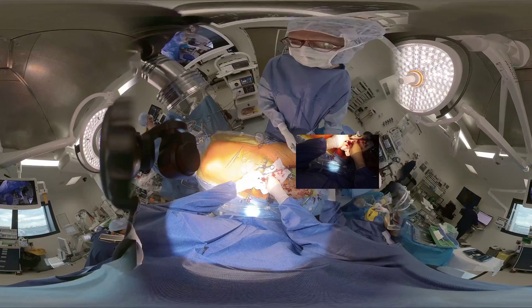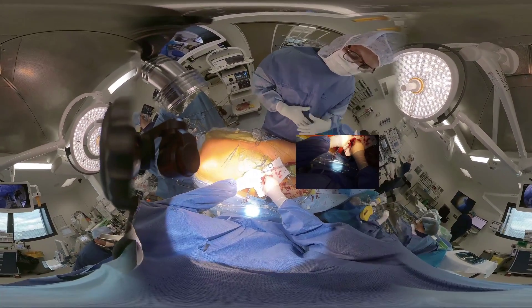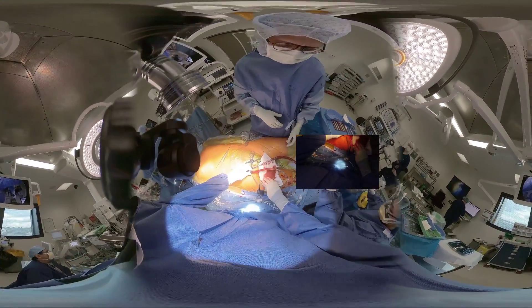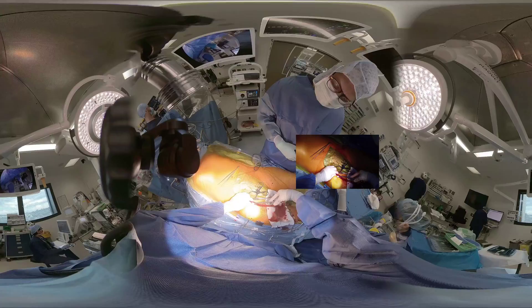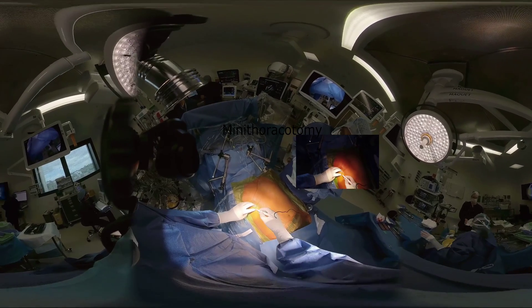The cannulas are connected to the cardiopulmonary bypass machine, and the patient is put on bypass.